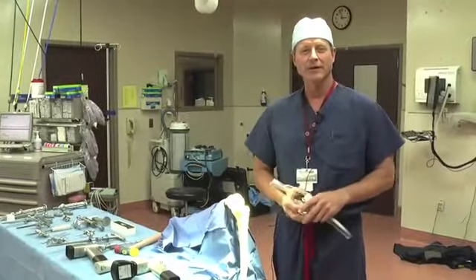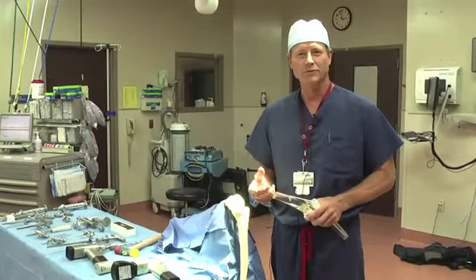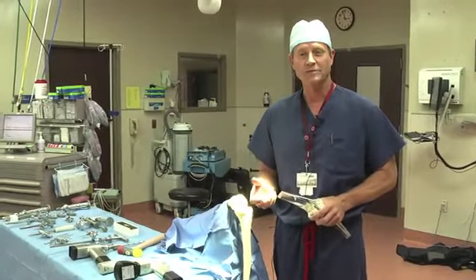Hey, I'm Dr. Eric Janssen, and today we're going to demonstrate what we call a dry bones model for total knee replacements.